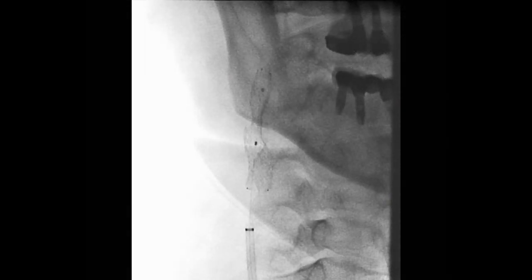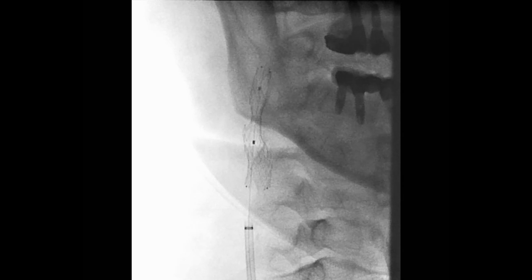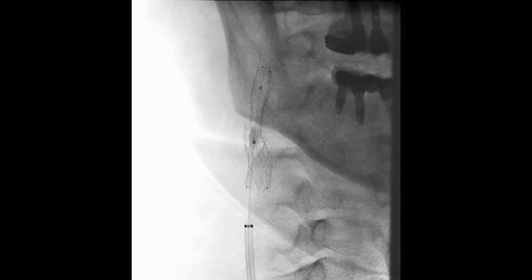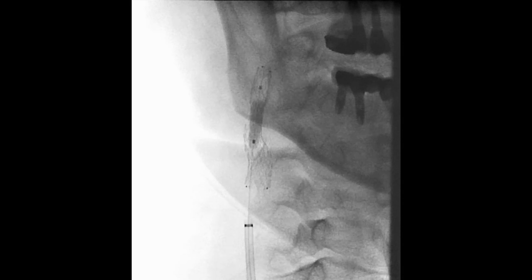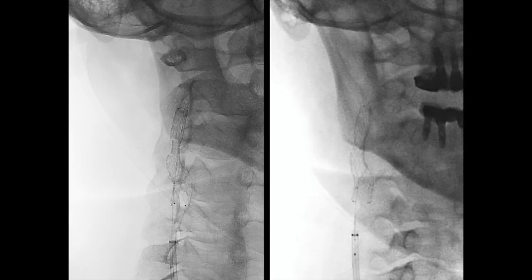Following deployment of the stent, post-implant dilatation is recommended with a 5 mm balloon in order for the PET mesh to fully deploy and provide optimal long-term embolic protection.